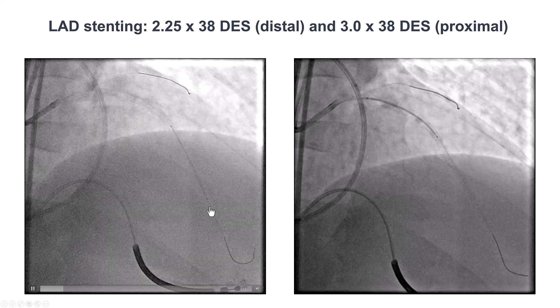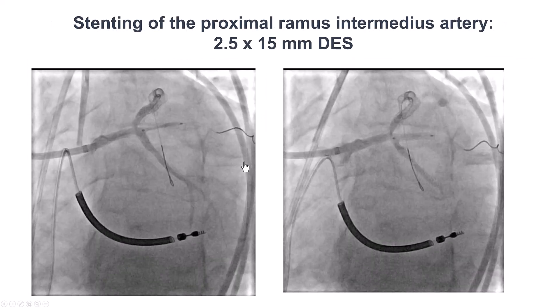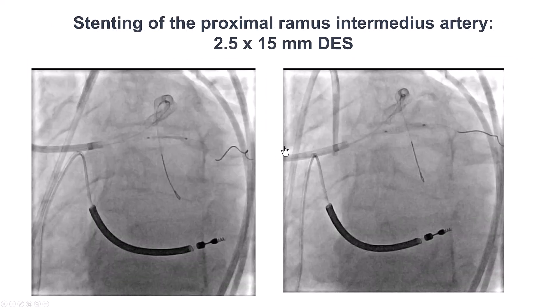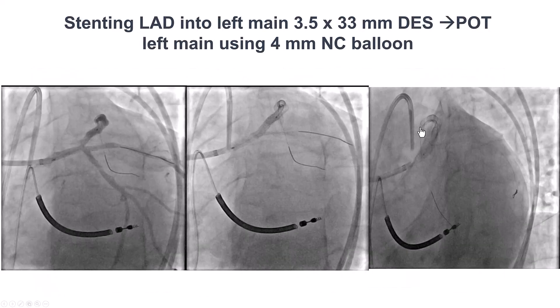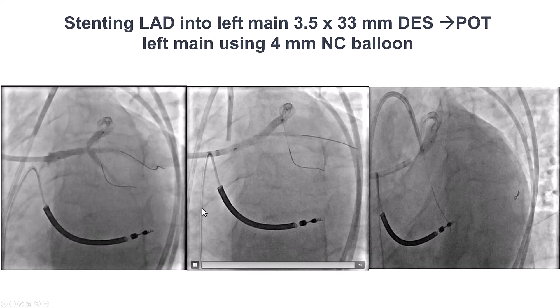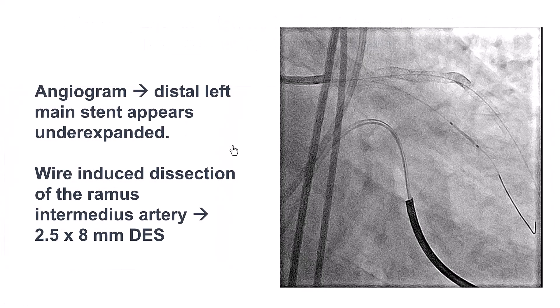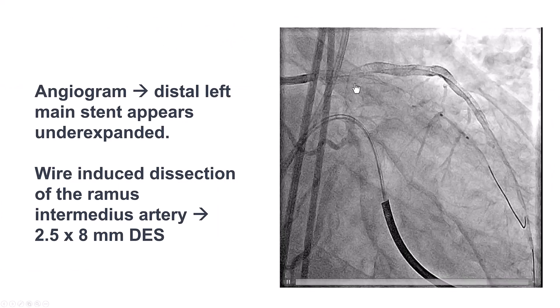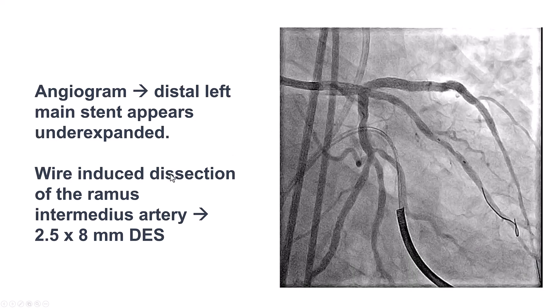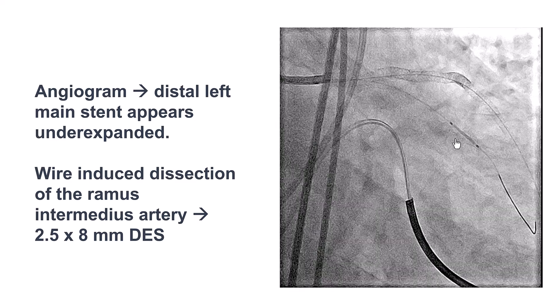We then stented the LAD CTO with drug-eluting stents in the proximal and mid-segment. And then we also ended up stenting the RAMUS, which did seem to have significant disease. And then we decided to stent into the left main using the provisional approach, since there was no significant disease in the origin of the circumflex. We did the proximal optimization technique, but there was under-expansion on the distal left main. And there was also a likely stent-induced dissection in the RAMUS, so we placed an additional stent there.